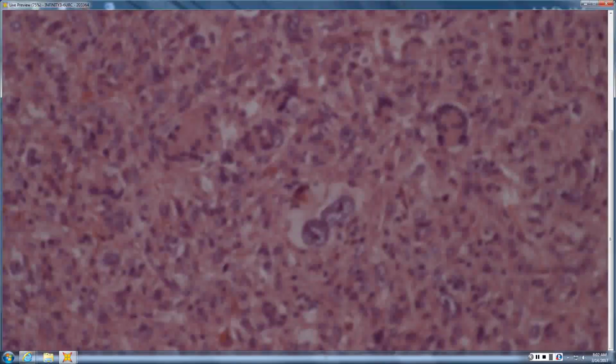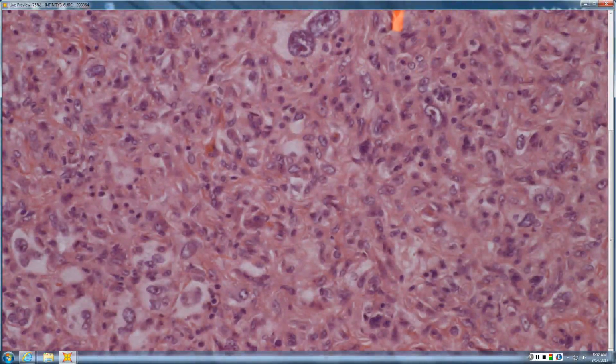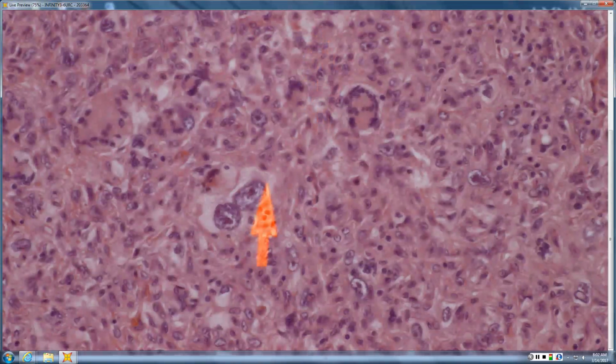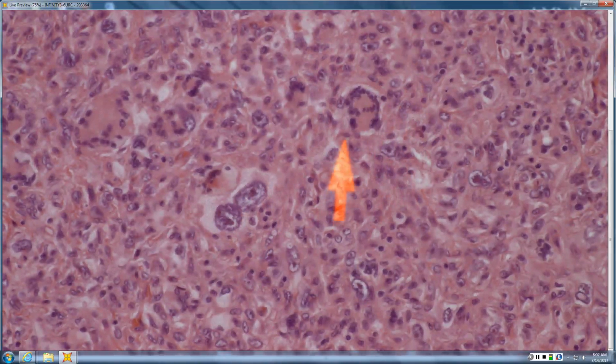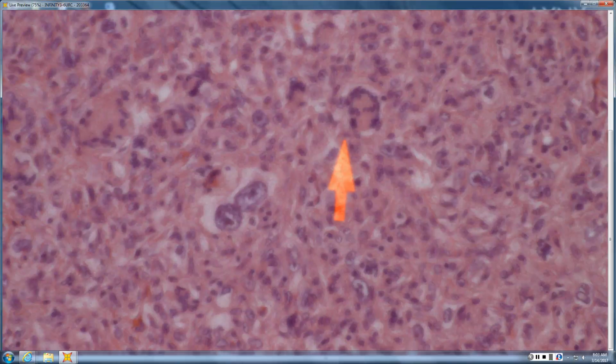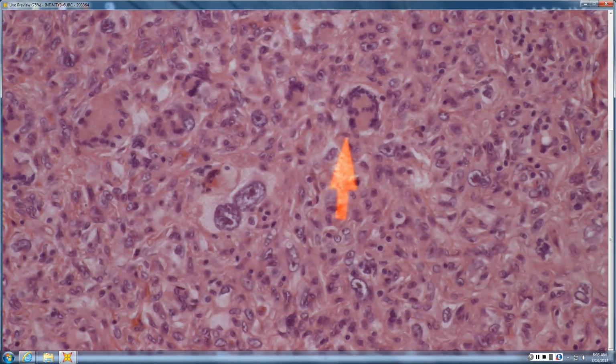So you have a large hypercellular proliferation. Is that a giant cell there? It is certainly a giant. Well, above it, that is a multinucleated giant cell. And this is a giant cell. Right, so you have both cells that are giant, and you have giant cells. And does that giant cell look like an osteoclast, or what kind of giant cell would that be? So I would say it's lining the periphery there. So they form a circle, a wreath.